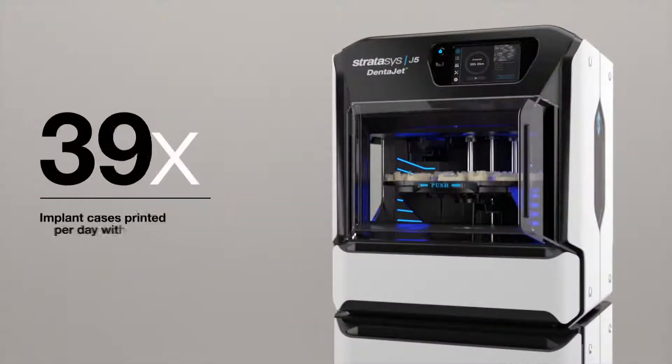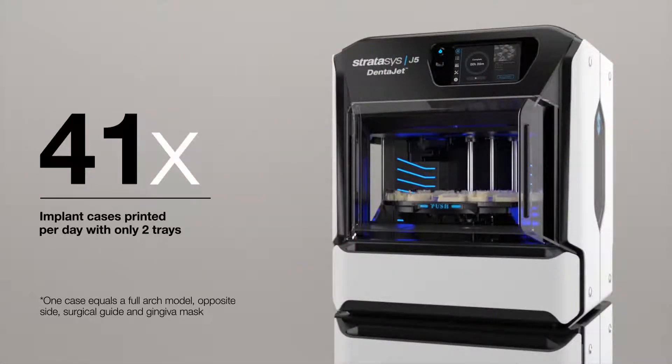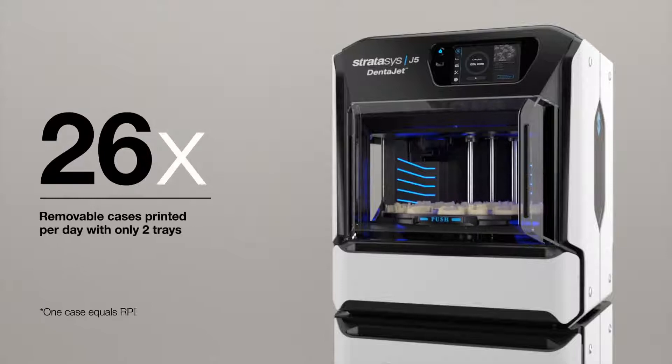Print as many as 41 implant cases per day, or up to as many as 26 removable cases per day, using only two trays.